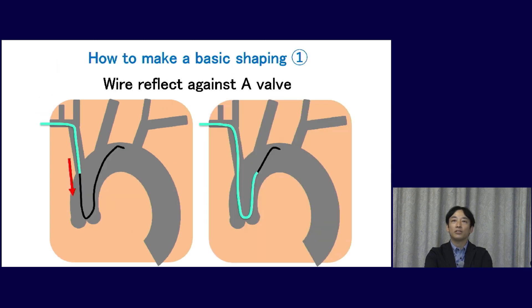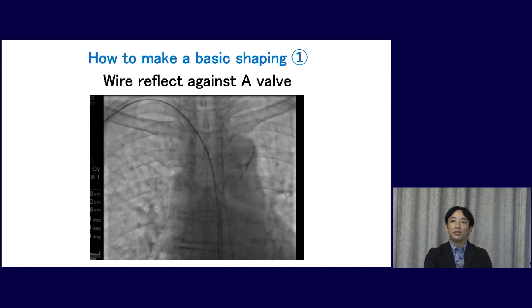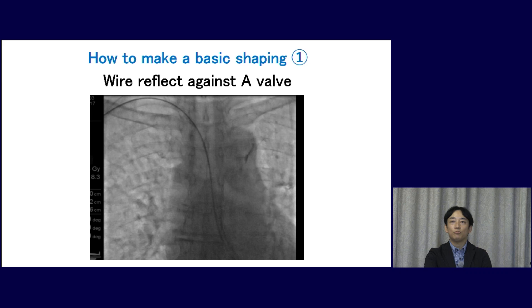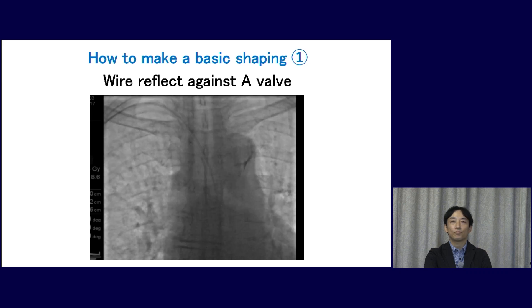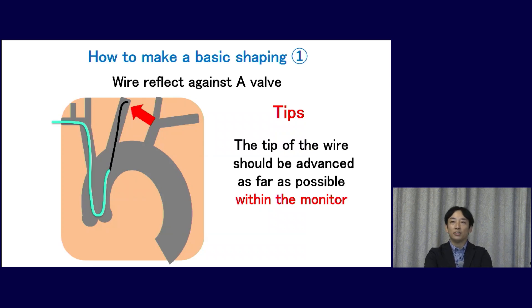The first technique is to reflect the wire against the aortic valve. This is the simplest method of all. In this video, the guide wire is navigated as a J-shape first, and then the Simon's catheter is followed. This is the basic shape of the Simon's catheter. The tip of the guide wire should be navigated as far as possible under fluoroscopic monitoring, and at the same time the tip must not be out of your sight.